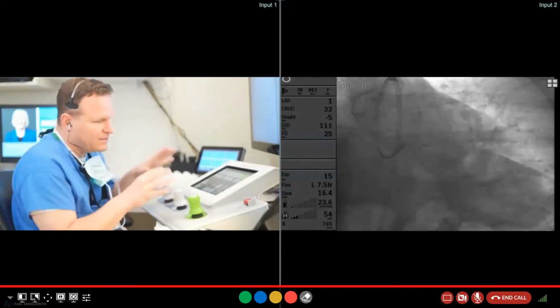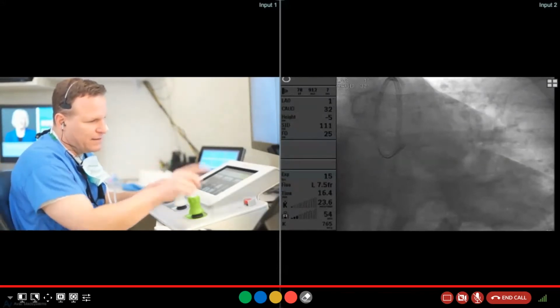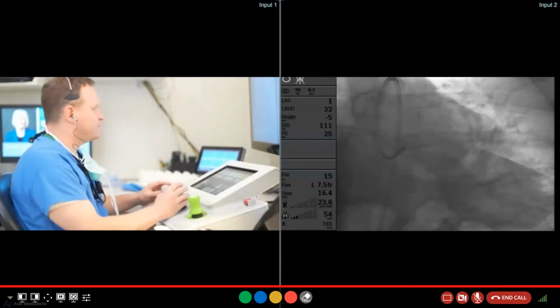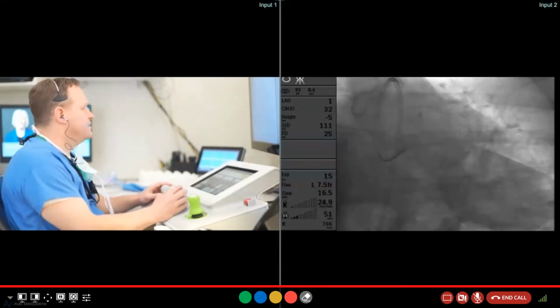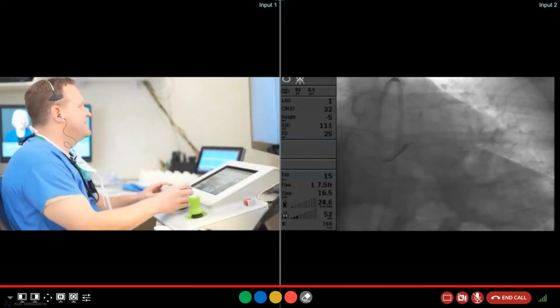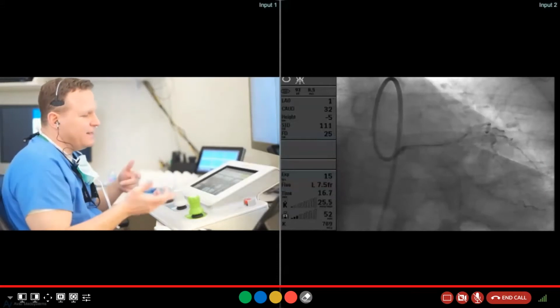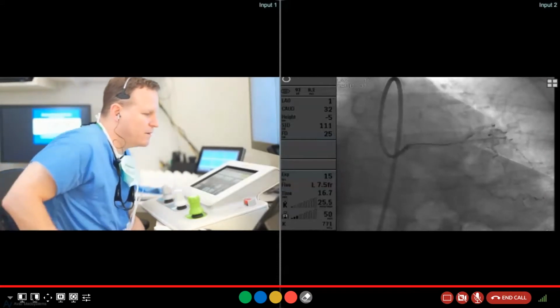I thought I'd do this just to show the hands here and what the actual fluoro is over there. Does that sound reasonable? Perfect. Good deal. All right, so you can see here, I'm easing in. I've got control of the tip going. Sam, could you just give a puff there, please? Perfect. So I'm in the LAD. Would you mind going to preset number 1 and going up to the RAO cranial shot?